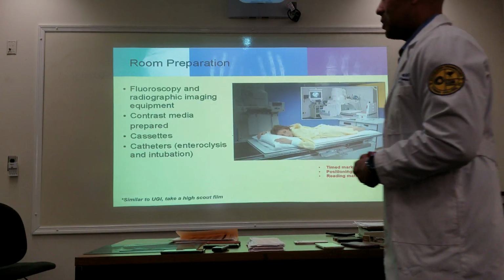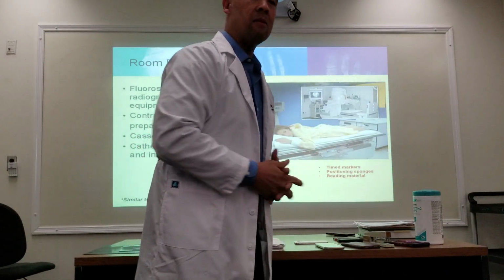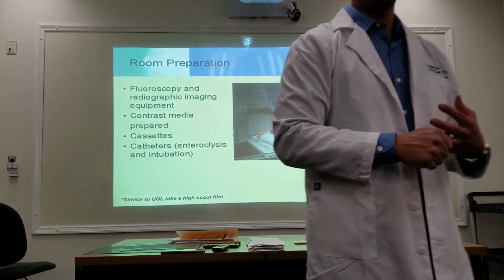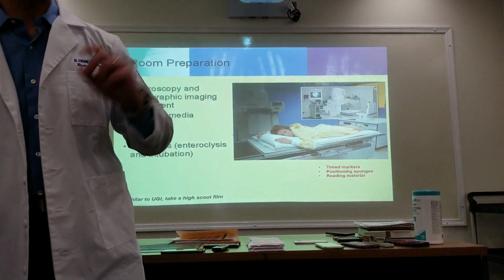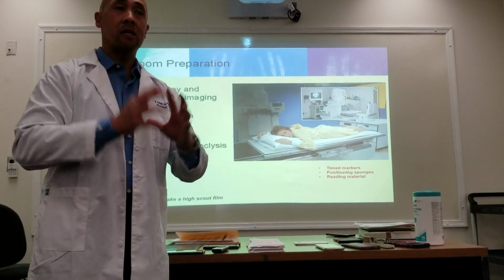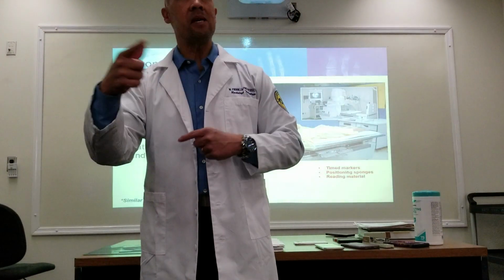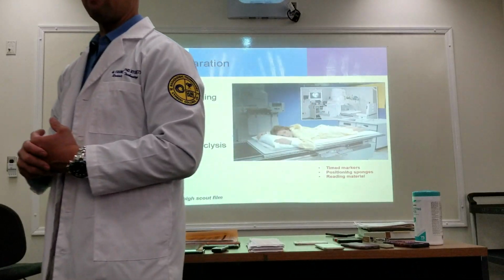Okay? So now you would show that image to the radiologist, share the history with that radiologist, and then the next thing they're going to say is, go ahead and start the study. Now again, we're just talking about the upper GI. So once the doctor says, go ahead and begin the study, you go into the room to get your patient ready for an upper GI.